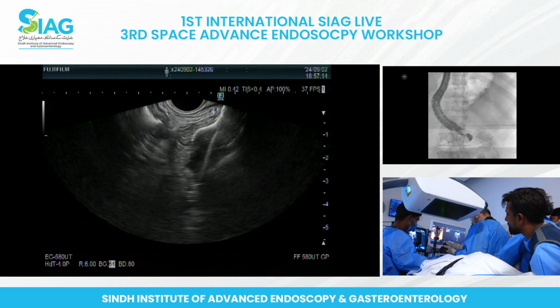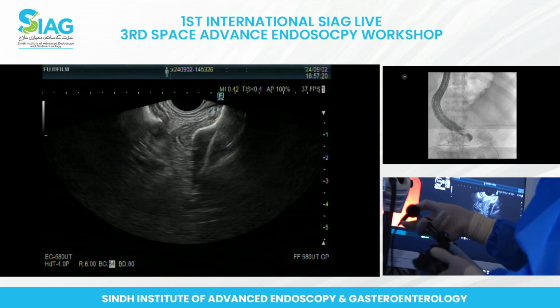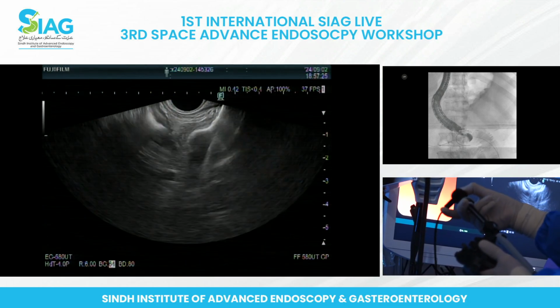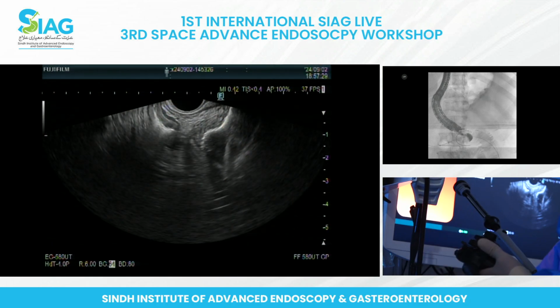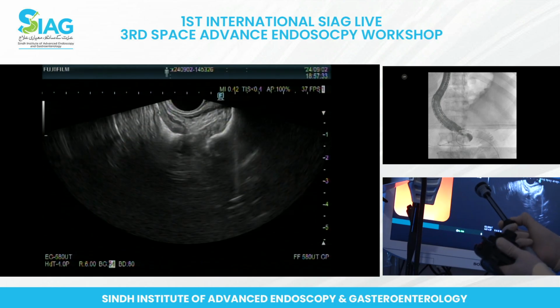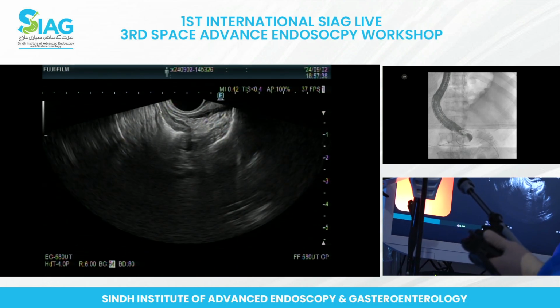Now it's fine. The inner dumbbell needs to be opened a little bit quicker. This one is going to stabilize when it's open. He's opening that into the scope. It's already open into the scope now. What he will do is he took the cautery off and now he's just going to push this. Can we have the endoscopy view, please?